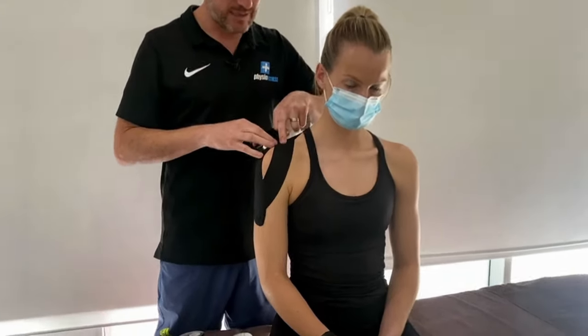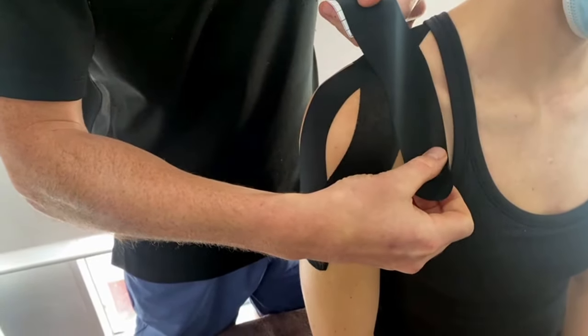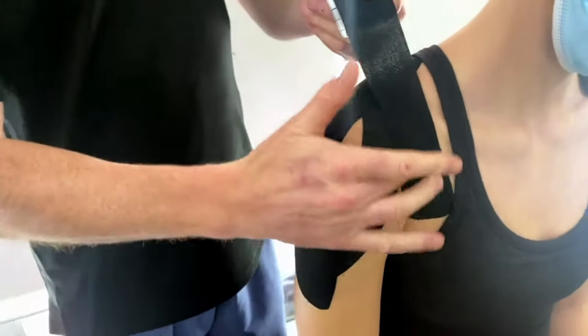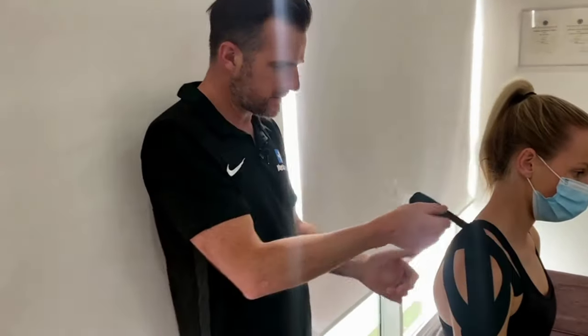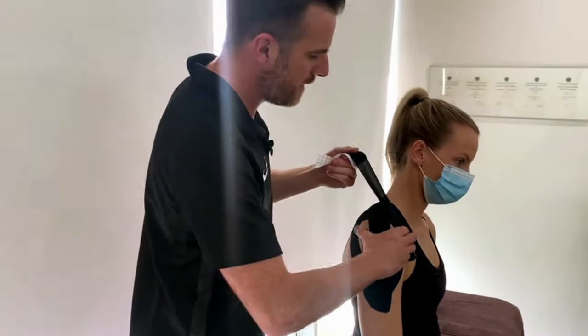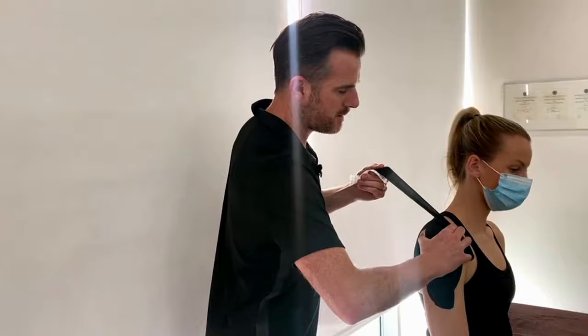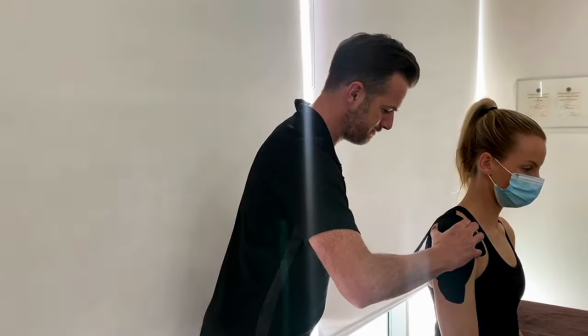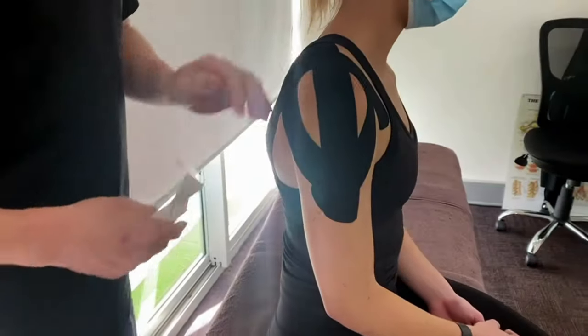Come from the front, follow the line of the collarbone, find where the AC joint is, and anchor a little bit on the medial side of that collarbone — just a touch on the pec as an anchor point before the AC joint. Then as you come over that collarbone, put a bit of pressure on as you push, almost pushing that clavicle posteriorly while holding the acromion, then 100% tension as you come down onto it. There's a backward downward pressure onto that clavicle. That first strip will take up some of the skin slack.